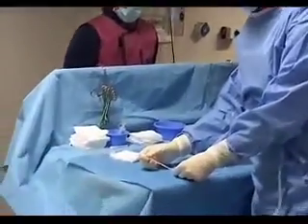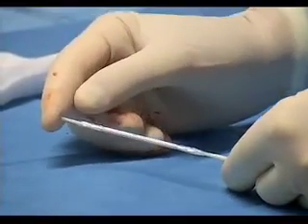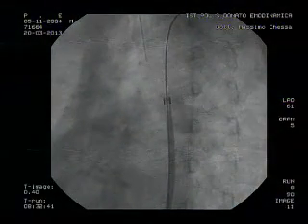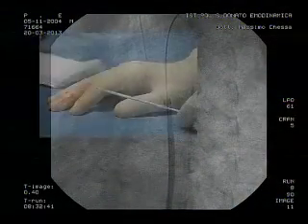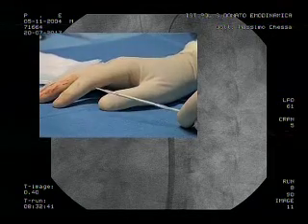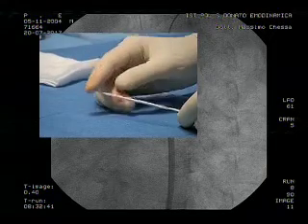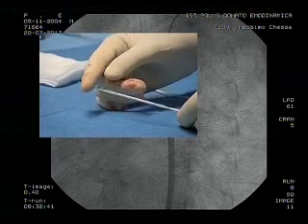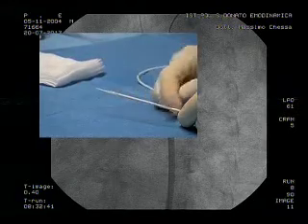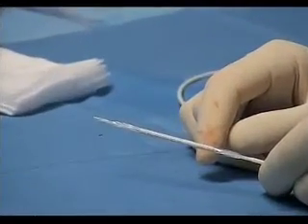Please zoom here. You know, this stent is probably a stainless steel stent with an open cells design, with some ePTFE on the interior and exterior aspects that covers it completely, encapsulating the stent actually. The length we choose is 41 millimeters.